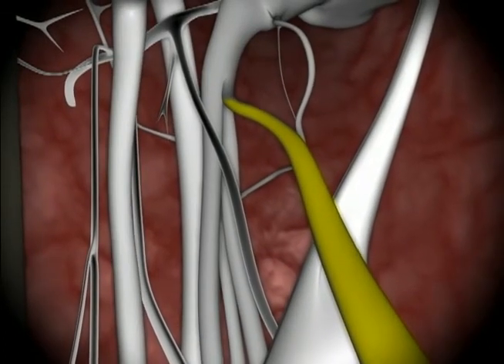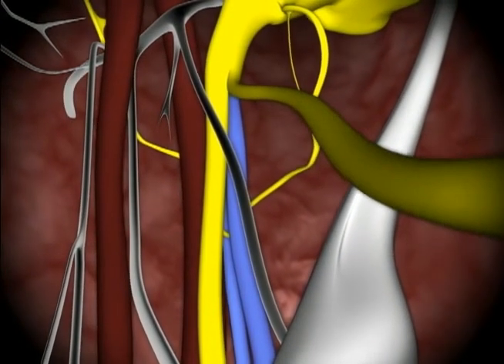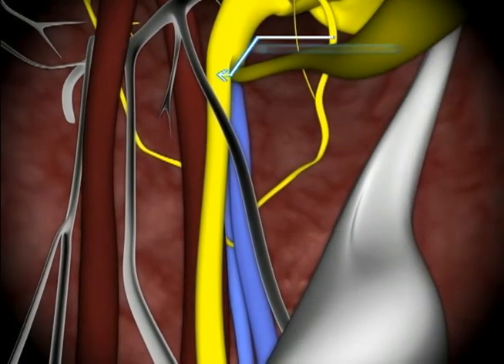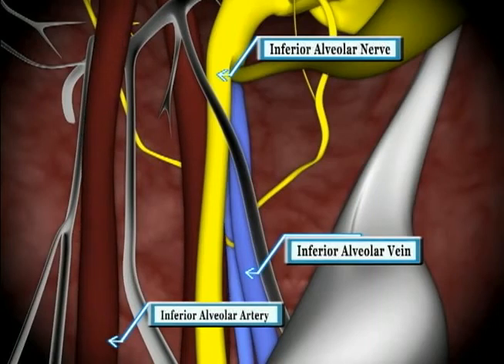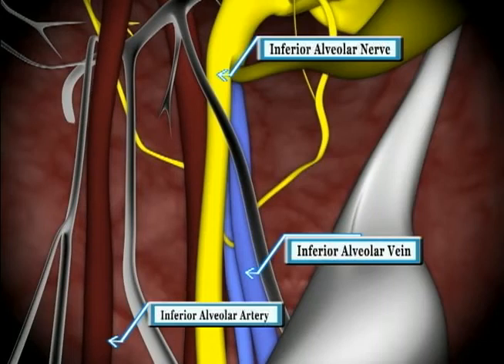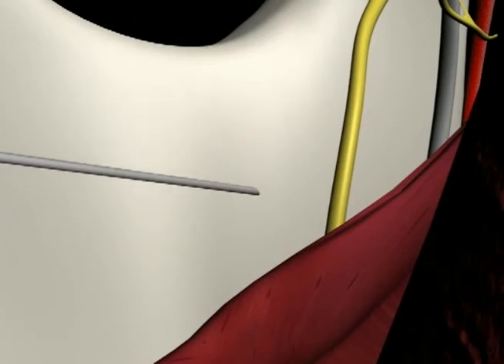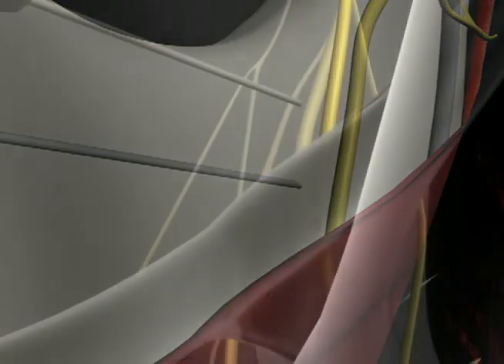We're just about there. Notice that we are approaching just above the lingual, and the inferior alveolar neurovascular bundle can be visualized. After traveling about 20 to 25 millimeters, we finally arrive and make gentle contact with the ramus, ideally just above the mandibular foramen and very close to the inferior alveolar nerve. We'll pull back a millimeter or two, aspirate, and then deliver the anesthetic.